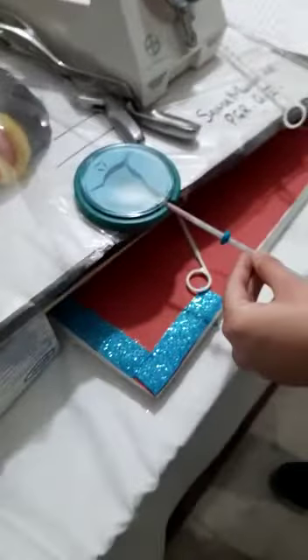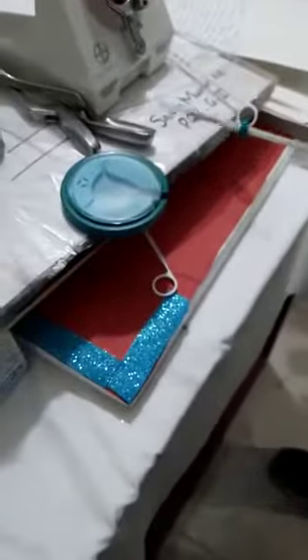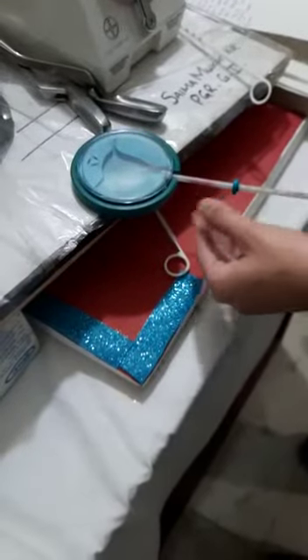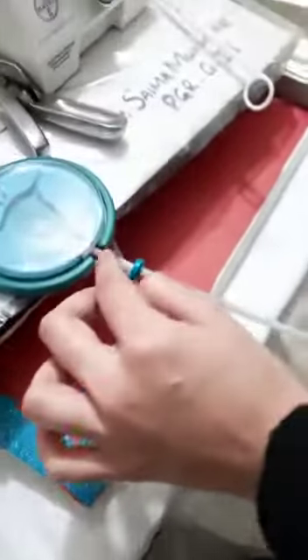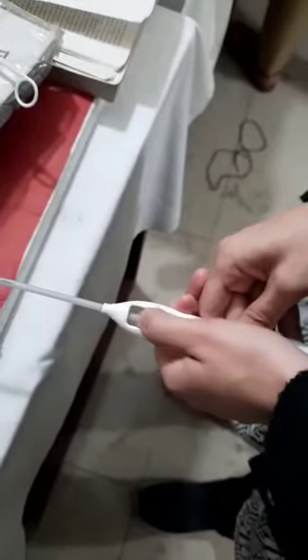I will position the shaft so that the flange is 2cm away from the os, with the flange kept farthest away. When the flange is 2cm away from the os, the slider should be at the raise point.